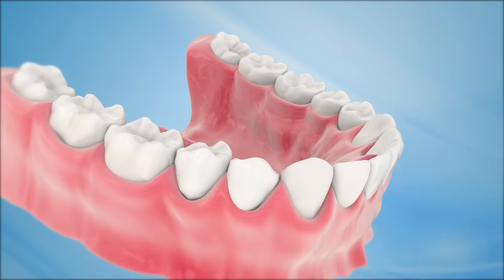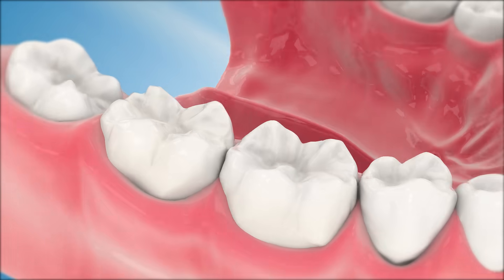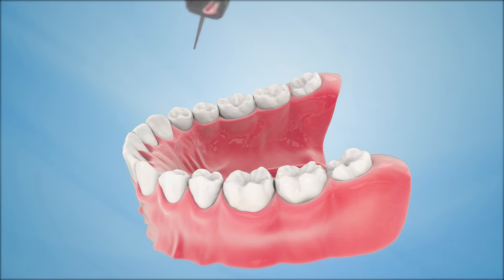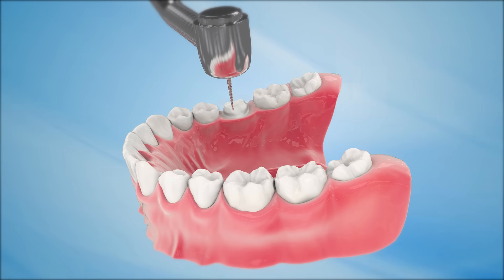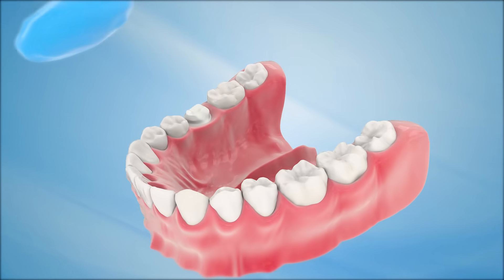The placement of a dental crown requires two visits to the dentist. During the first visit, anesthesia is applied to both the tooth and the surrounding gum tissue. Once the area is numb, the surface areas of the tooth are shaped to ensure sufficient space for the crown. After reshaping the natural tooth, the dentist will use a paste or putty-like material to take impressions of the remaining tooth.